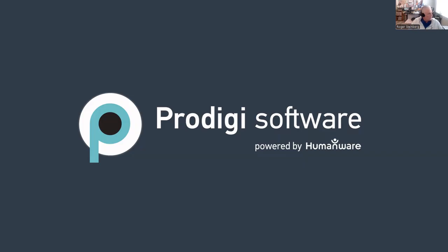So I think we have a couple that need a little bit of orientation to what we are all about with Prodigi for Windows. So we will try to deliver a presentation that fills in on the highlights of it and what it's about. Again, this is HumanWare Live. I'm going to show the new features that are coming in version 1.3. I will provide a quick overview of what the Prodigi for Windows software is.